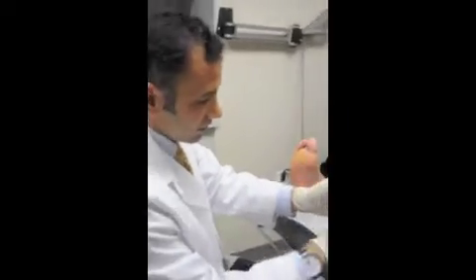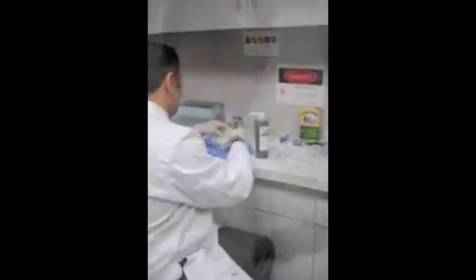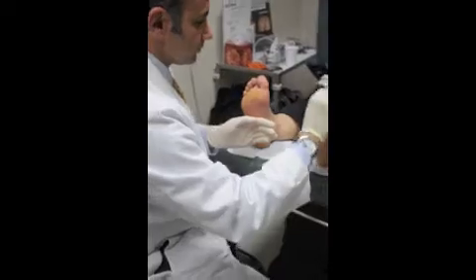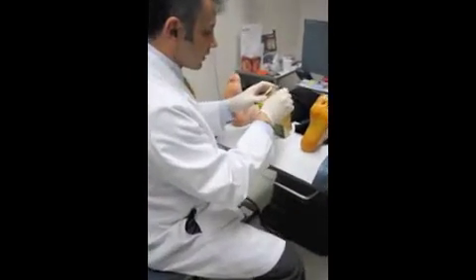Next we're going to get some iodine, paint it on the bottom of the foot, with a little bit of cornstarch on the tip of it.